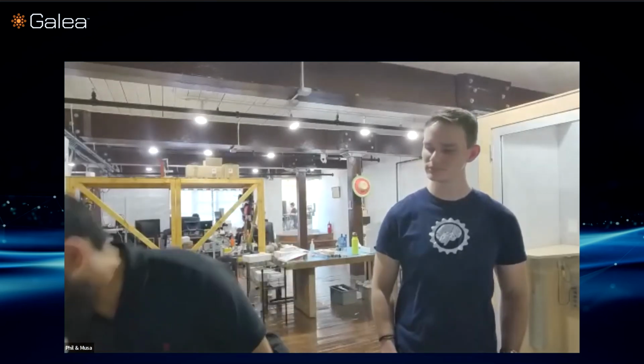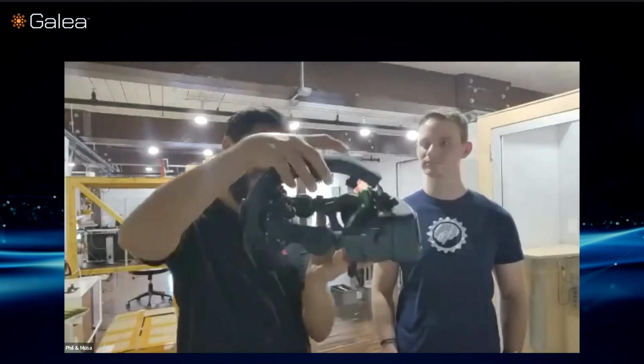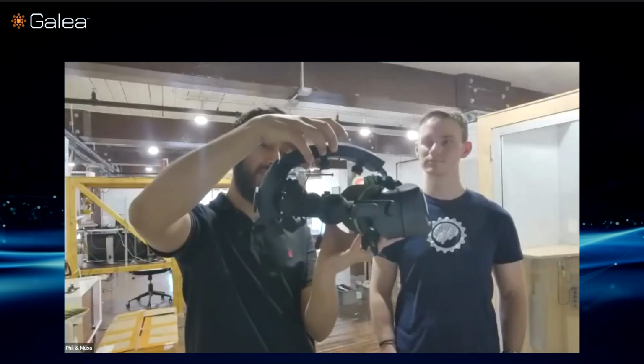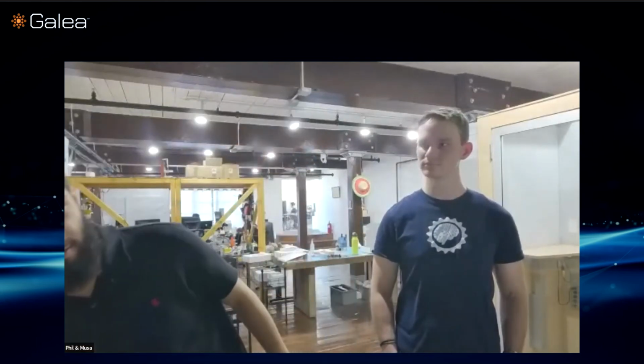Yeah, so I discussed this with the hardware team earlier. We're looking to add more EEG channels, particularly on the current design. I can pull it up. We're missing out on the parietal and temporal area. So you can see there's just a hole directly through it. In that blank space, we're going to add at least a couple of electrodes so we get more of that motor cortex information and parietal lobe information.